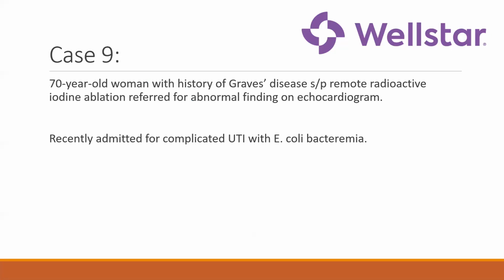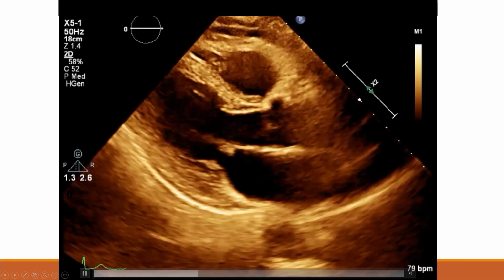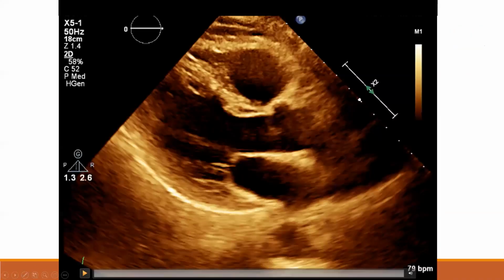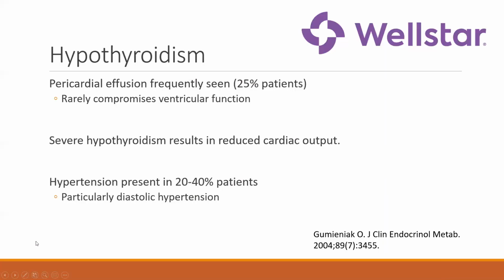Here's case 9, where this is a 70-year-old lady with a history of Graves' disease, status post remote radioactive iodine ablation, who was referred for an abnormal echocardiogram. Interestingly, she was recently admitted for complicated UTI with E. coli bacteremia. She got an echo because of the bacteremia, although it was gram-negative bacteremia. And here was her echo, and you can see that there's a small pericardial effusion. Now, this patient was asymptomatic, but they were essentially referred to assess for the cause of pericardial effusion. And as it turns out, the patient hadn't been as compliant with their Synthroid.